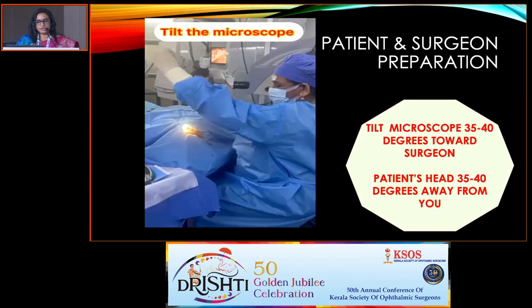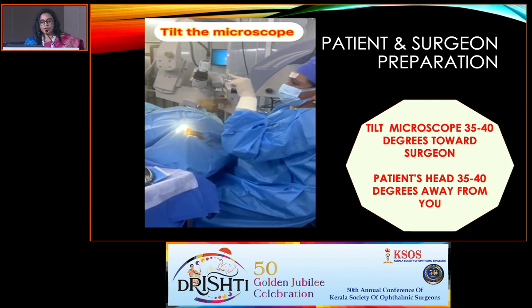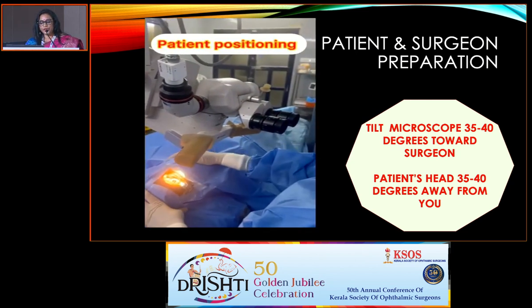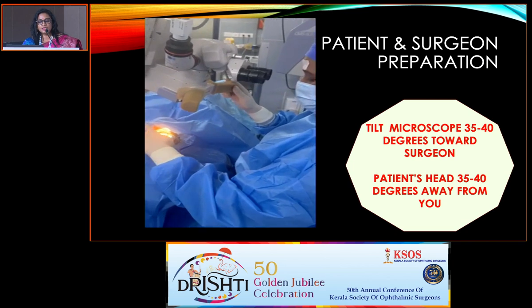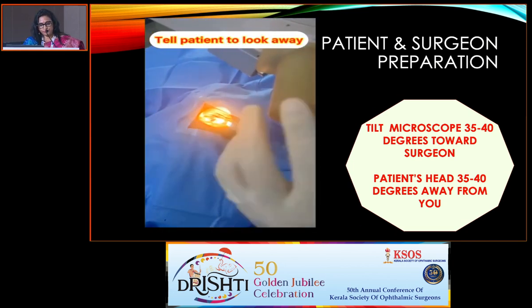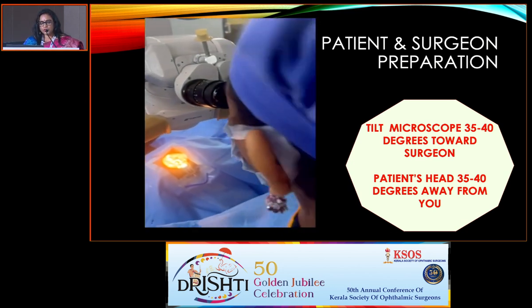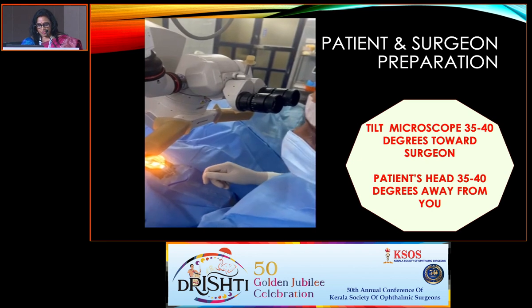So now how do you prepare yourself? It is not only you, you have to prepare the microscope also. It requires a tilt. You need a microscope where you can tilt the head. You have an arrow mark in the microscope that shows how many degrees it is tilted. You can tilt it around 35 to 40 degrees. Then you move the patient's head away from you, around 35 to 40 degrees, and ask the patient to look away from you. These are the preparations you do before you go and do the gonioscopy. And because you want to avoid unnecessary neck movement, you can lift the knob under the eyepiece so that you can comfortably sit and do the gonioscopy.